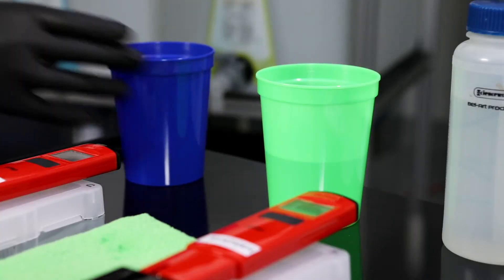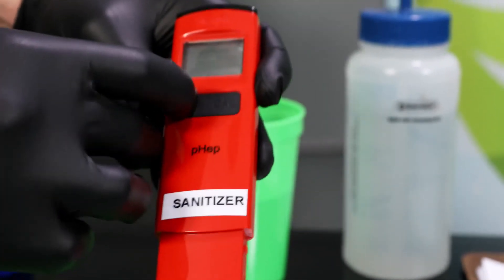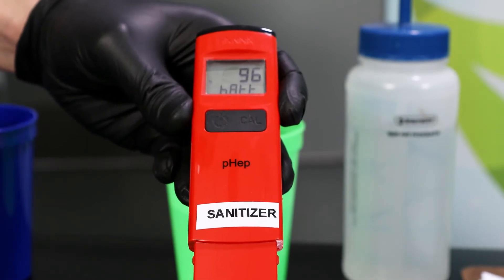Turn on each Hanna pH meter by pressing the power button. Once the screen displays numbers, it's ready to take a measurement.